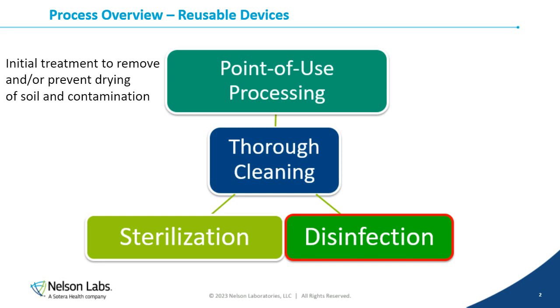That's what was discussed on the presentation yesterday, was how to do the cleaning, how to do the validation for that thorough cleaning procedure. After that cleaning procedure, the device will then either go through sterilization or disinfection as the terminal step. And so today, what I have highlighted here is the disinfection portion, and that's what we'll be talking about.